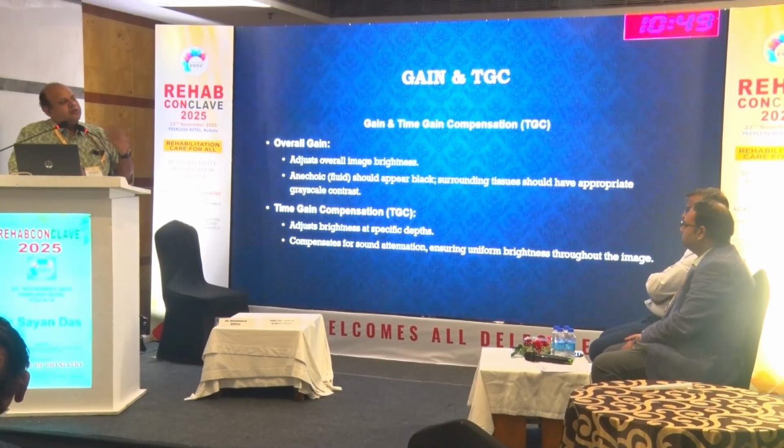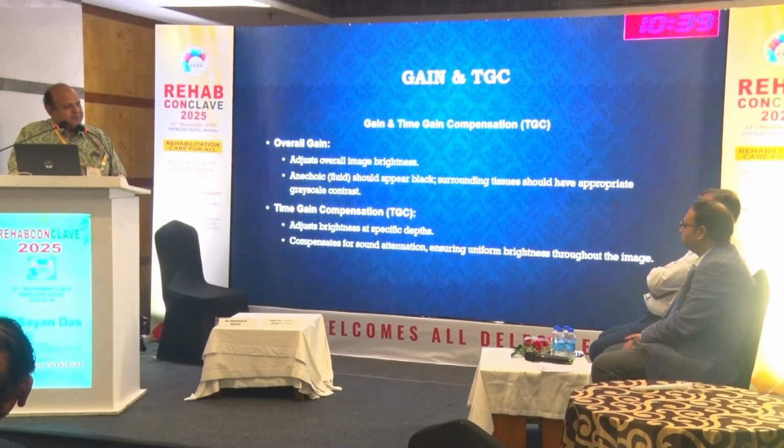That gives you more homogeneity, because sometimes when the patient is having a lot of fat, the superficial structures look brighter than the deeper structure. So you can reduce the superficial TGC and increase the deeper TGC. That gives you more homogeneity.